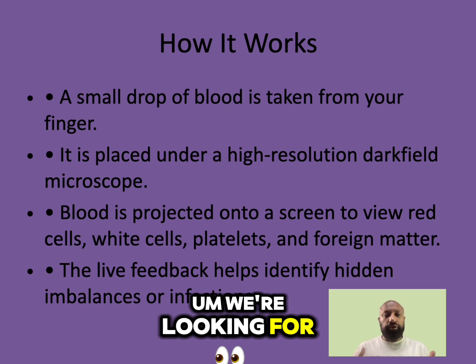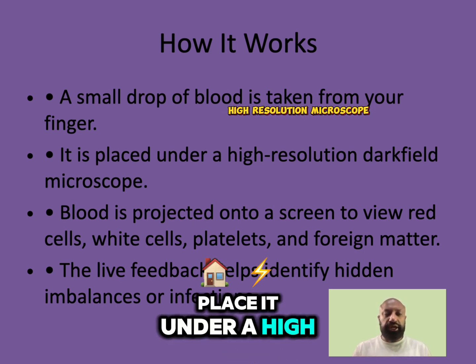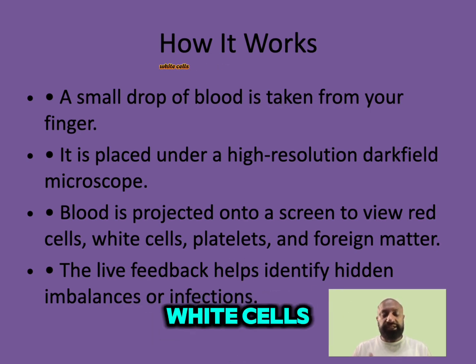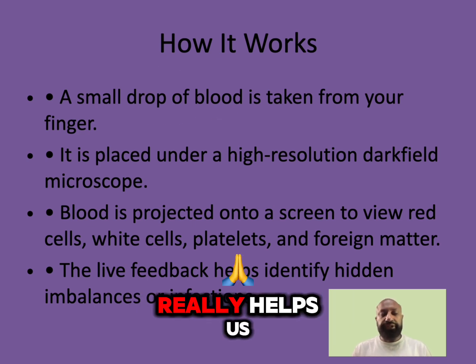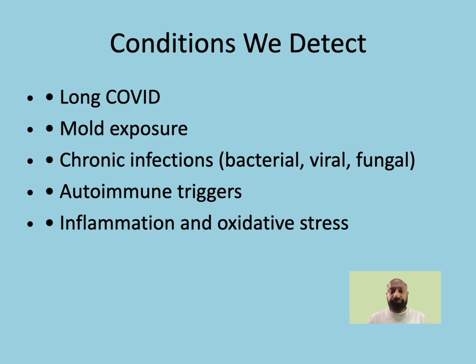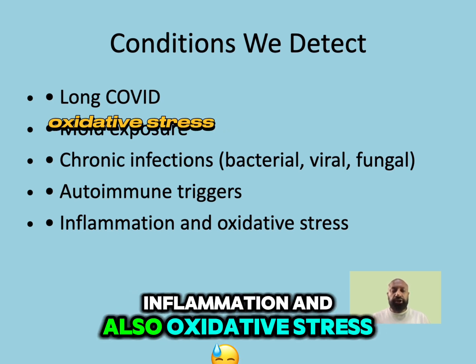We're looking for just a small drop of blood, and then once we place it under a high resolution microscope, we can actually change the phasing of that to see different things. So we're looking for white cells, platelets, foreign matter, and that live feedback really helps us figure out if there's any type of hidden imbalances or infections that may be underlying.